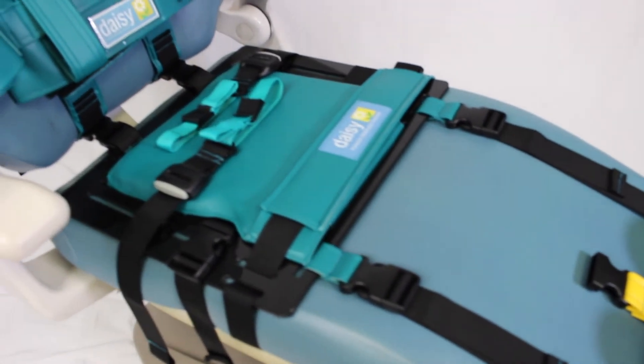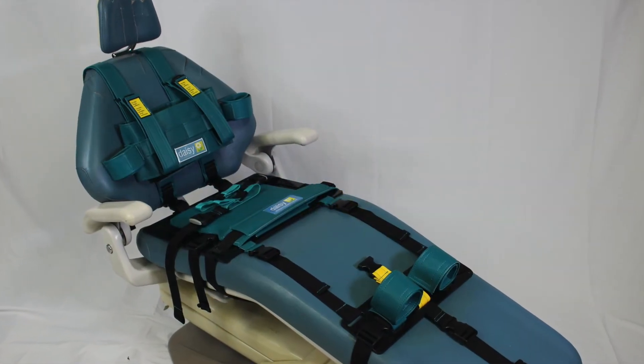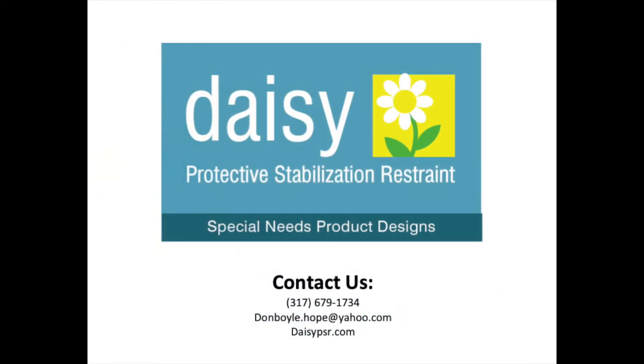This completes the installation of the DAISY PSR to the dental seat. Please see the separate video for the positioning of the patient in the DAISY PSR. For any questions about the installation of the DAISY PSR to the dental chair, please contact us at 679-1734 or leave us a message on the contact page of our website.